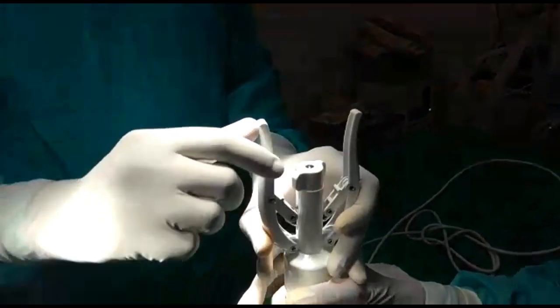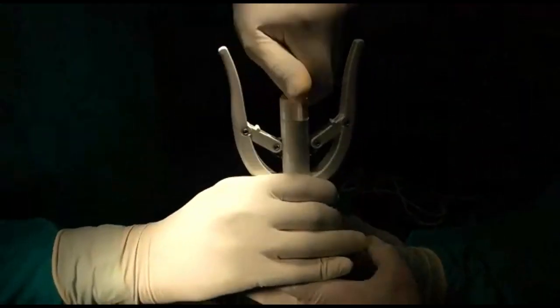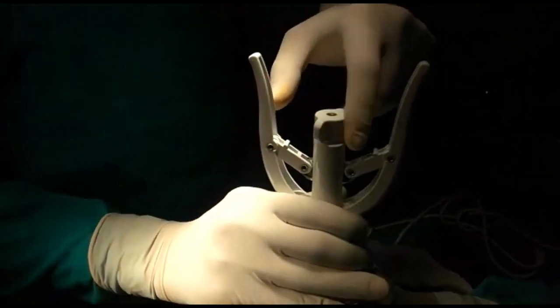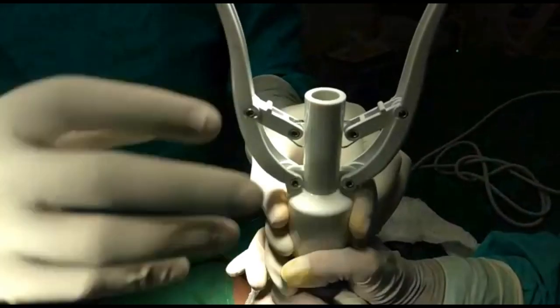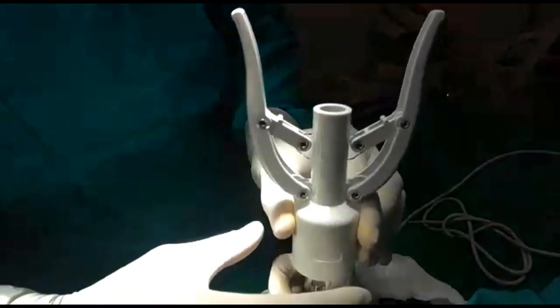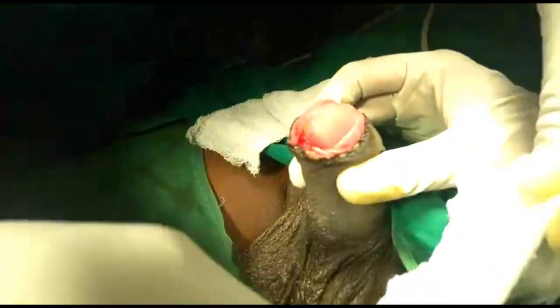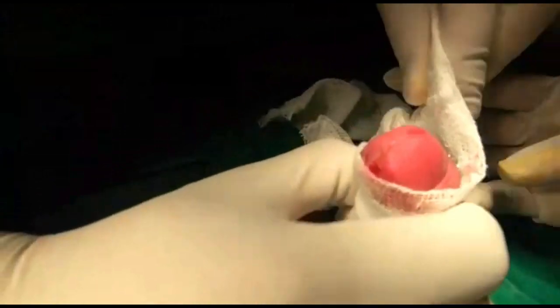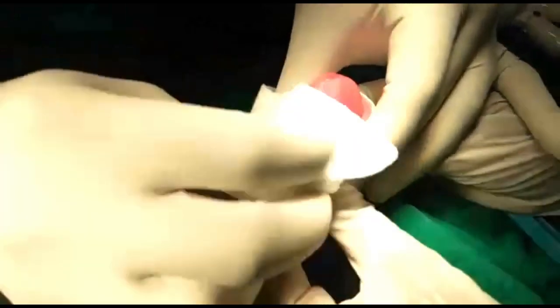So we are going to release this, and I am going to unscrew this again. I compress on the plastibel and just remove that. You see how beautifully this has been cut. All I need to do here is clear pressure for about 3 minutes, and this procedure is done.